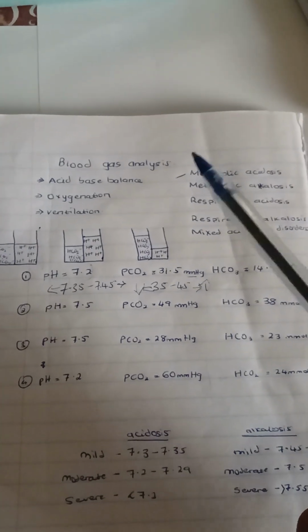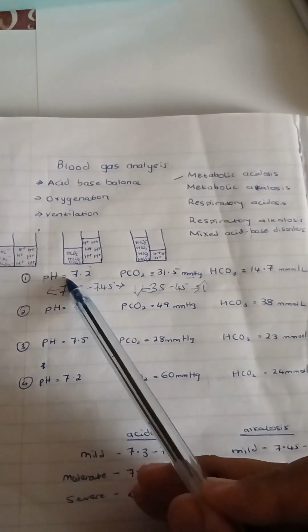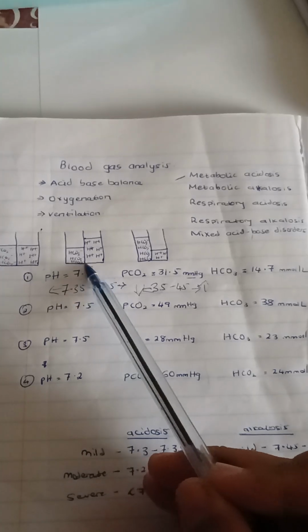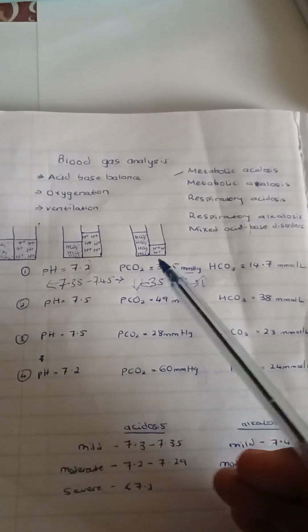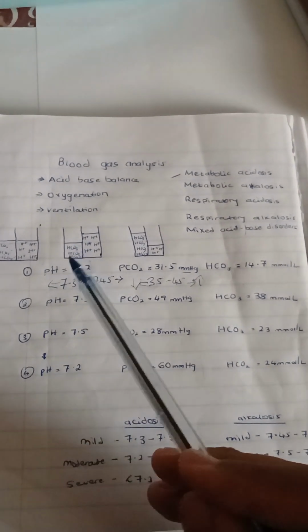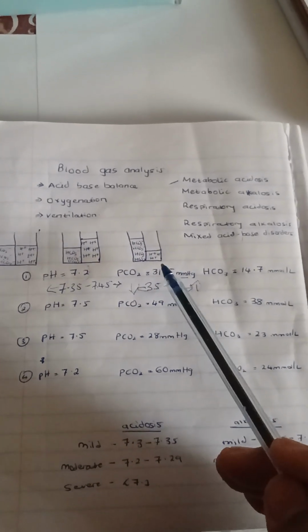So how will we know whether it's raised or reduced because of the primary problem or because of compensation? You can know that by looking at the pH. If the pH is acidic, it's pointing towards acidosis. And if the PCO2 is pointing towards acidosis, that is, if it is higher than normal, then that's the primary problem. If the pH is acidosis and the PCO2 is pointing towards alkalosis, that is, it is lower than normal, it means it's compensation.